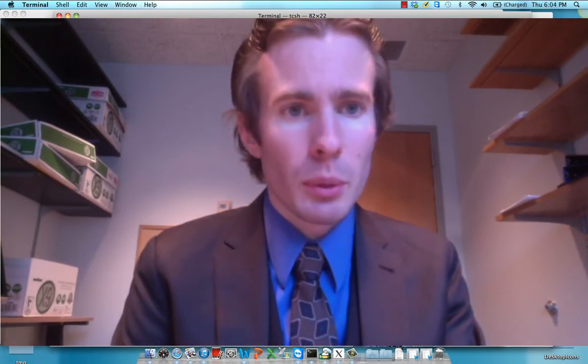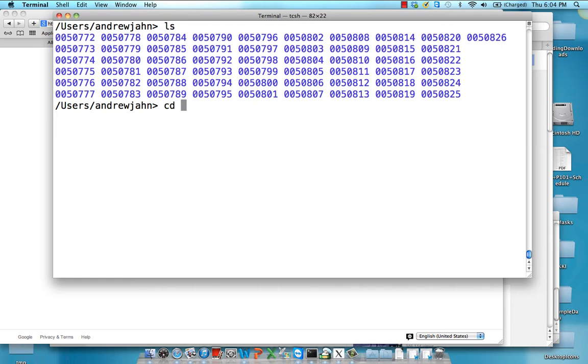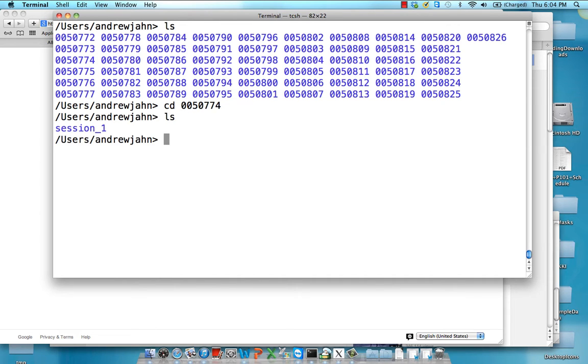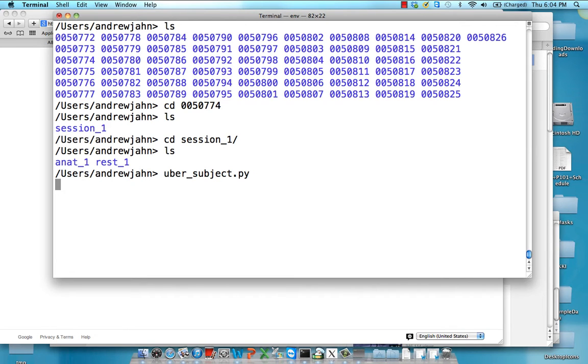So what I'm going to show here is just a simple dataset and how we would set this up with uber_subject. Within each of these we have session one, and then we have an anatomical and a resting state dataset. So from here I'm going to boot up uber_subject.py.